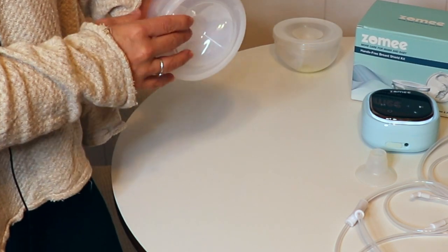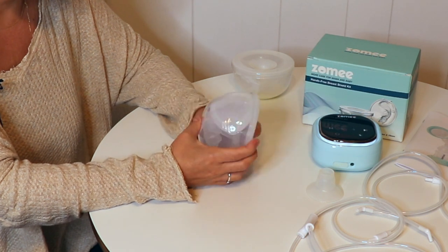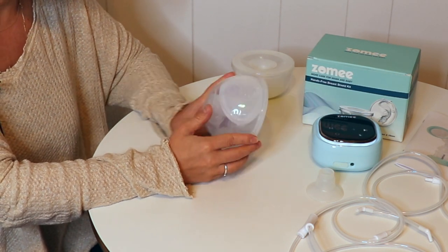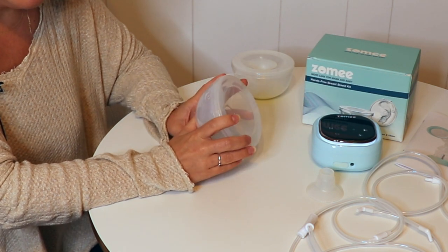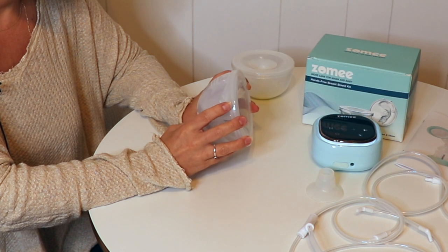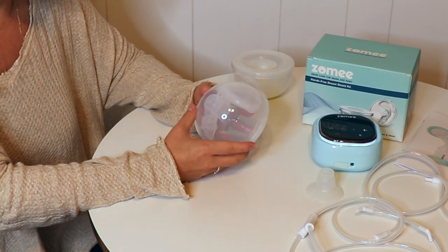Press until it snaps into place. This thing is a little bit tricky to put back together, but my assumption is that it's because I'm new at this and that it does become easier. I've also had a hard time with other wearable pumps getting the pieces together, but once you get the hang of it it's usually not that hard.